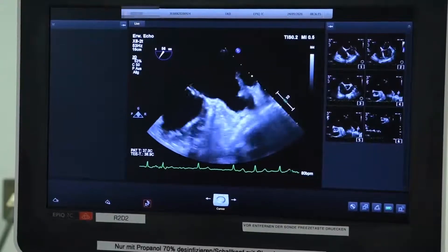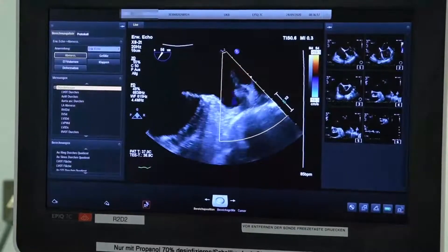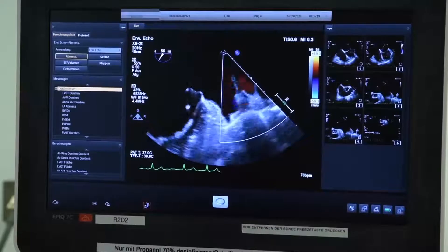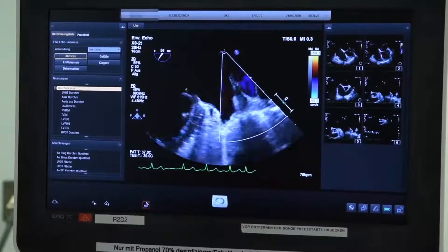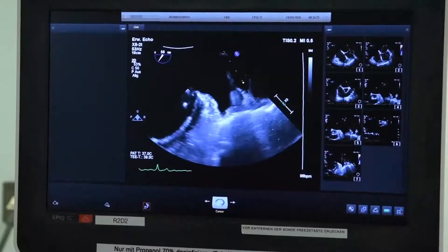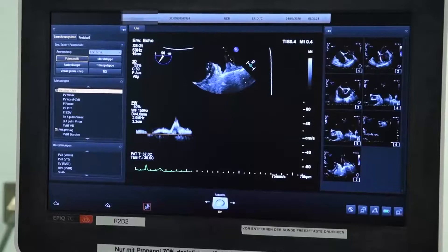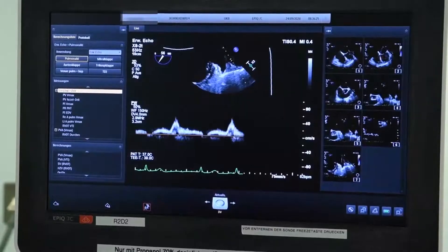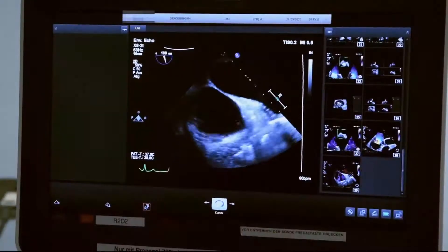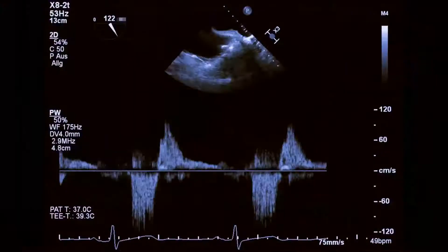Show the short axis view with focus on the left atrial appendage. Sweep at 40 to 60 degrees and rotate the probe anti-clockwise to show the left upper pulmonary vein. Assess the flow in the right upper pulmonary vein by sweeping at 90 to 110 degrees.